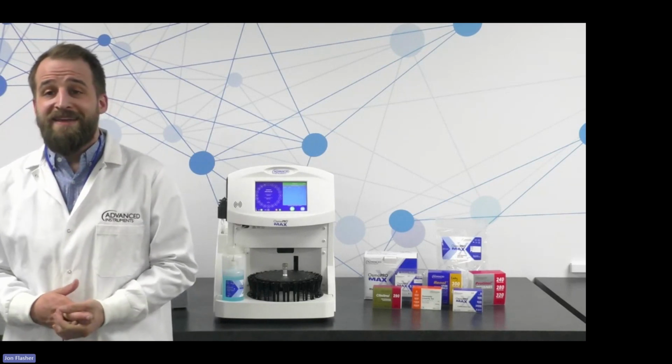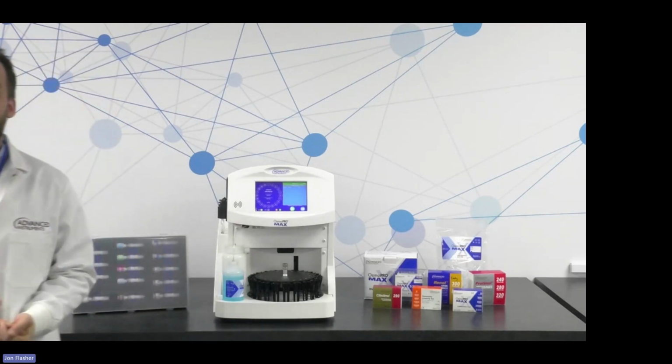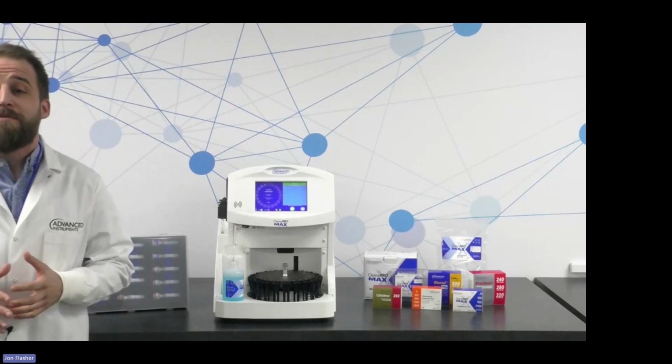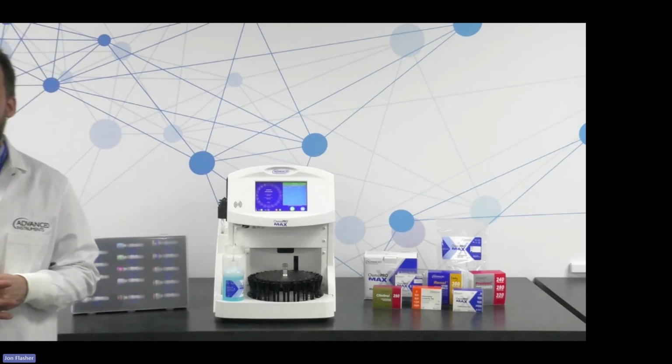So that said, without wasting much more time, we'll get right into this very cool instrument. So at a high level, a little bit about the OsmoPRO Max is that for Advanced Instruments, it's a first of its kind, fully automated multi-sample osmometer.